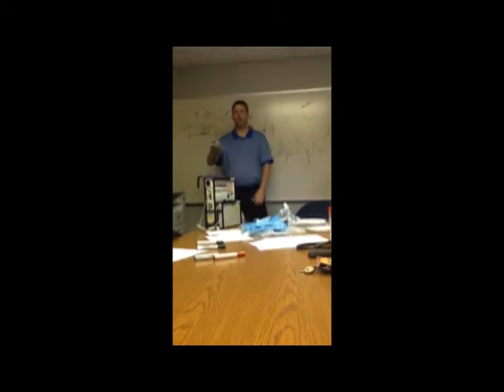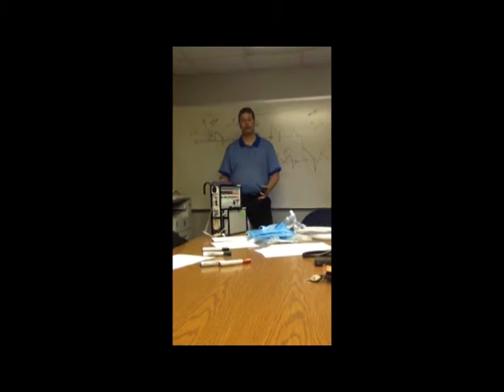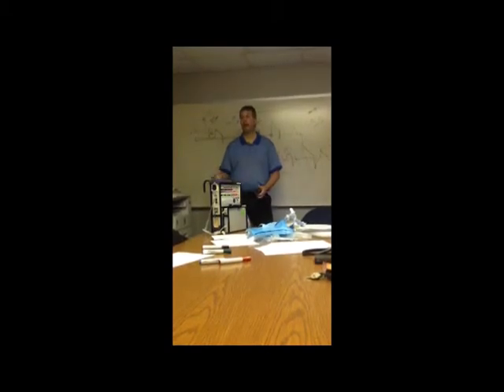If I get up to 80, I need to have it at 10. And so we do them this way, all right? I wouldn't do that in an emergency or in the back of the bus. And we do that to use the lowest FiO2 possible, but we're talking long-term, and FiO2 long-term makes the tissue of the lung brittle. So we like to keep everything under 60 if at all possible.